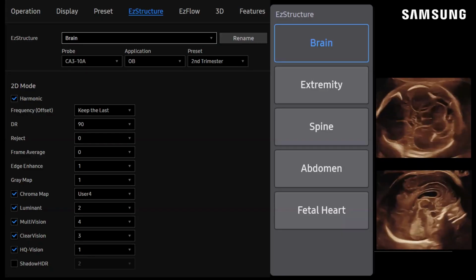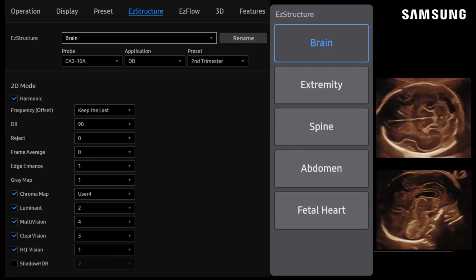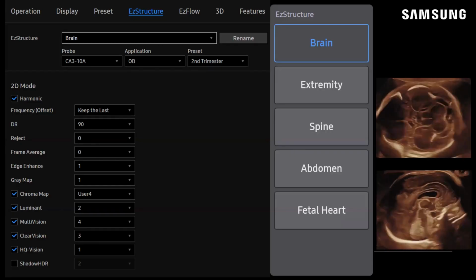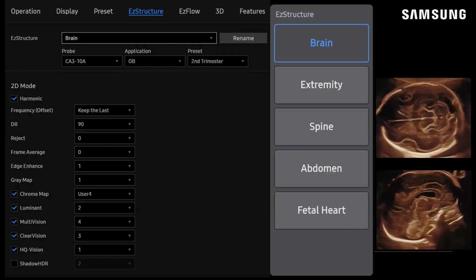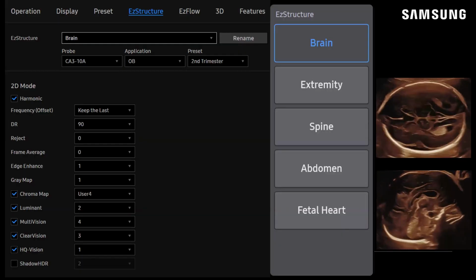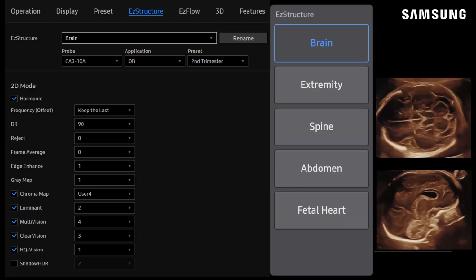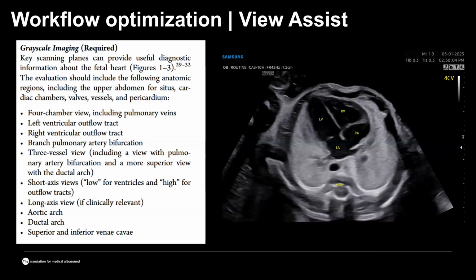And if you think about that, this is something that we always do when we scan adults and children. So for example, within the abdominal preset, we have the preset for kidneys, for liver. So this is the same concept, but applied to fetal imaging. So the workflow also matters. Sometimes you look at the keyboard of the ultrasound system, you see all those buttons, and you feel that you're in the space shuttle or you got lost.